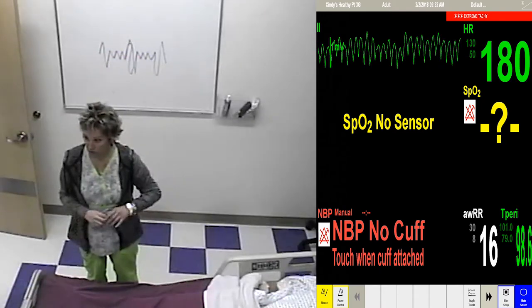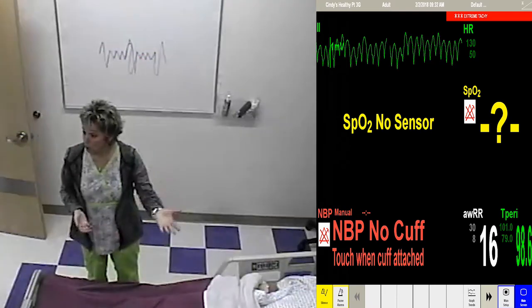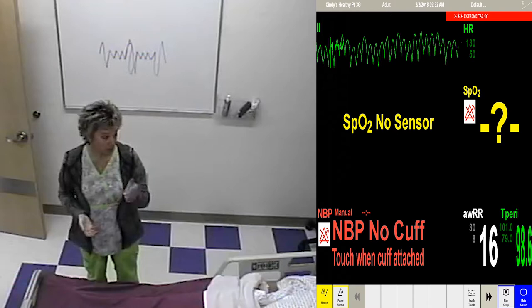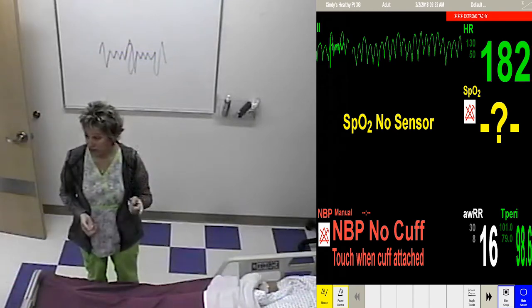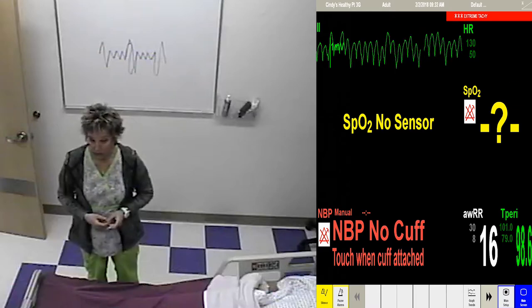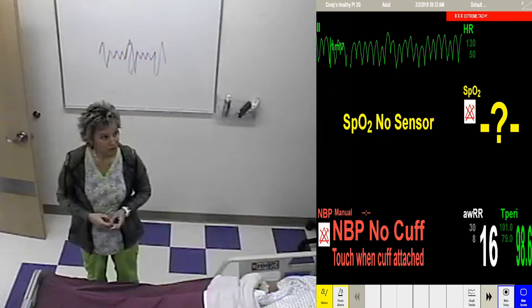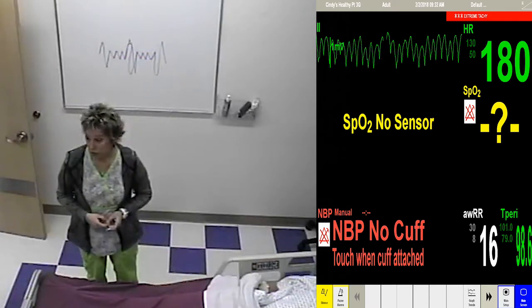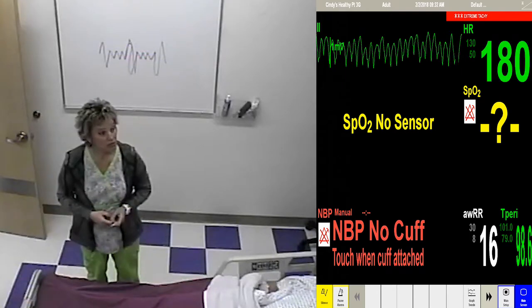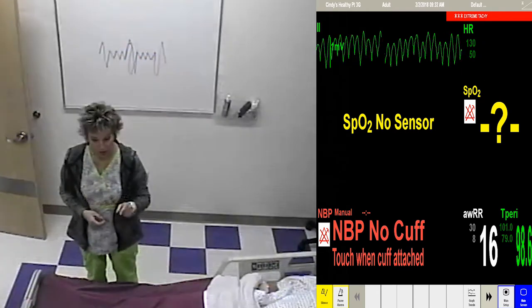What's the first word? Ventricular. Very good. Ventricular, because it's only QRSs. It's only the bottom part of the heart. A normal heart rate is? 60 to 100. This one is too high. Our nursing word for too high a heartbeat is tachycardia. So this rhythm is ventricular tachycardia.